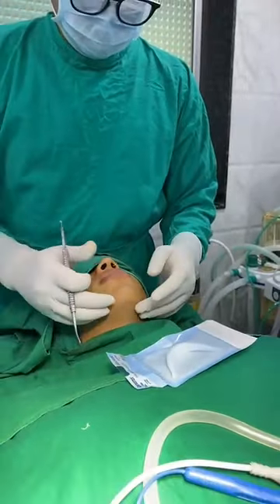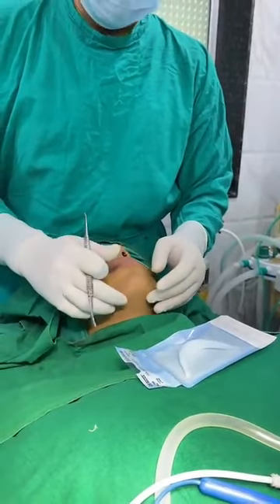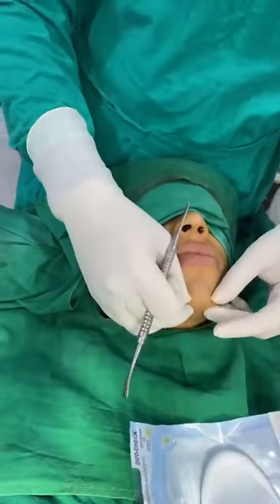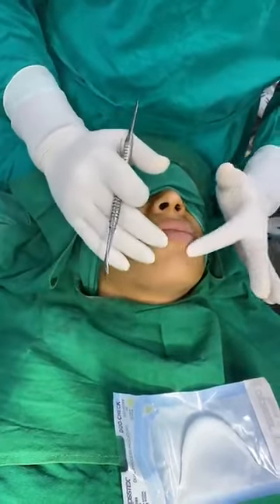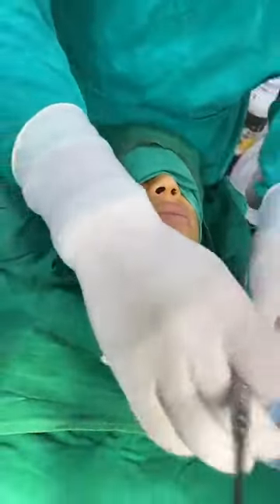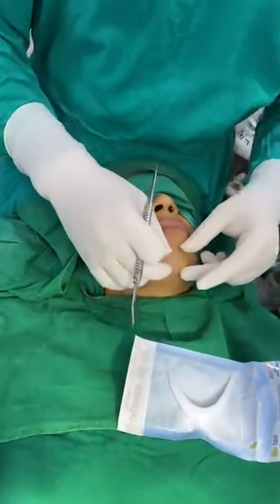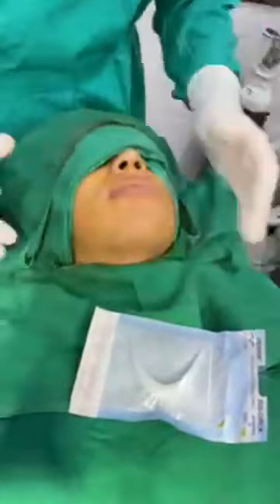I don't consider that a very good practice, because once we are tying it to the muscle, the implant keeps moving, and there are a lot of studies which explain that the movement of the implant can cause bone resorption. So the best thing to do is to go through the mouth. We can make a small incision, place this implant on the chin and put 2 screws here, and these screws are going to hold it onto the bone. The implant gets held to the bone and stays there forever.